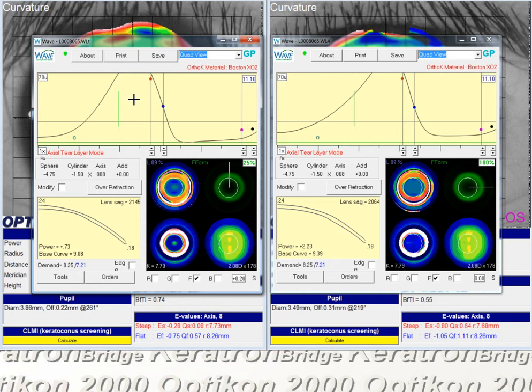Even without bubbles, though, we can get to a point where there's so much clearance that the fluid gradient is not strong enough to distribute forces evenly. So where we have excessive clearance, we get less molding. In this case, it'll be the vertical meridian where we are trying to get more molding. But without going to a semiscleral, this is probably the next lens change I would make.